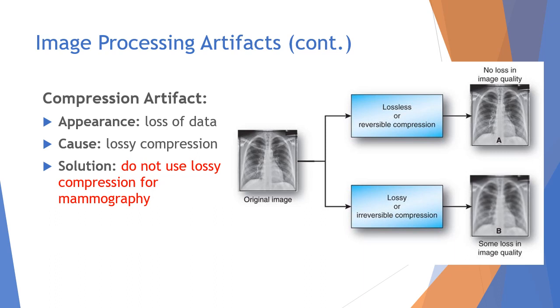Compression artifact is a loss of data, so we call it lossy compression, which is irreversible compression, and we don't want to use that for mammography. There's going to be some loss in image quality.